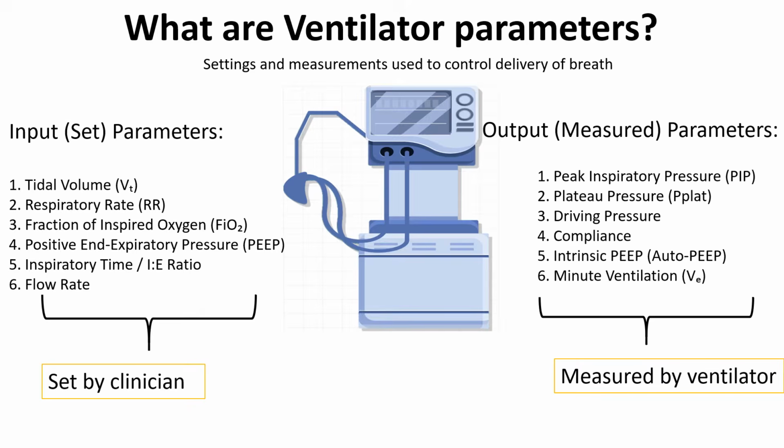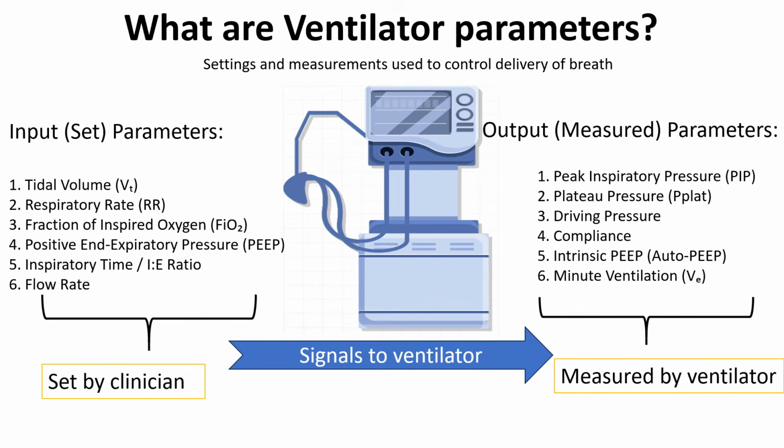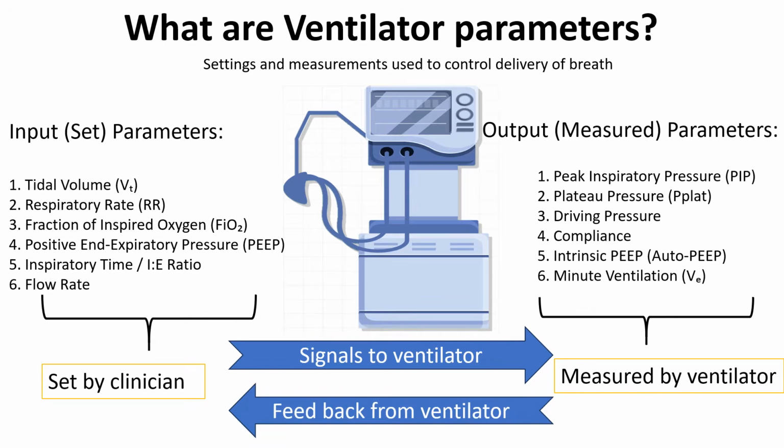The inputs directly signal the ventilator to deliver the breath. The output parameters, reflecting the patient's response to ventilation, help in assessing the effectiveness of ventilation and performing necessary adjustments.